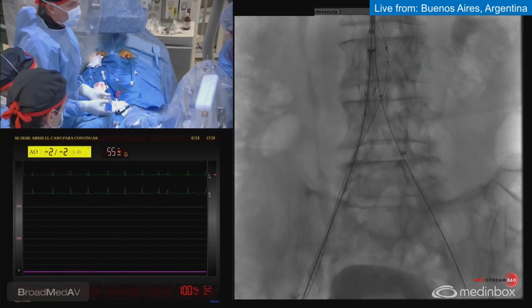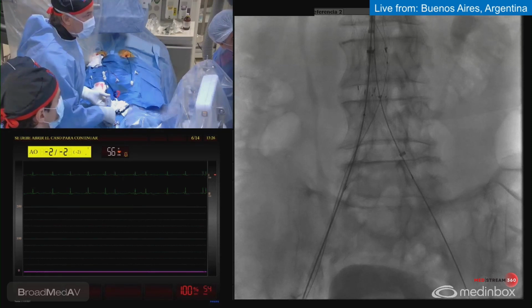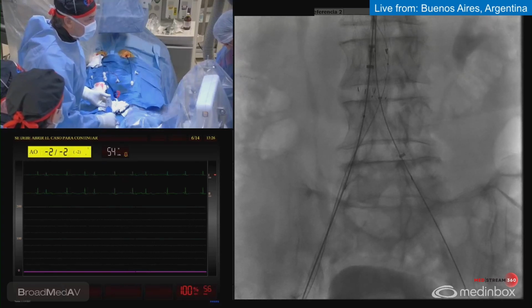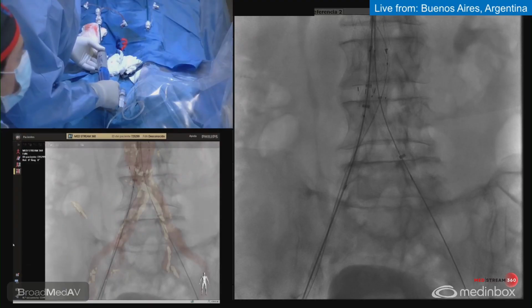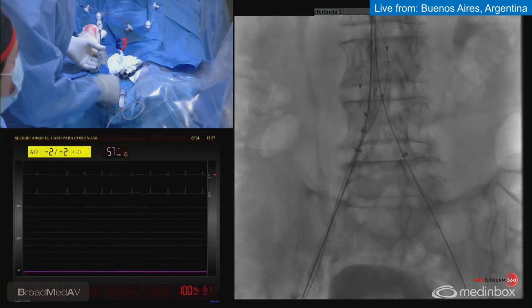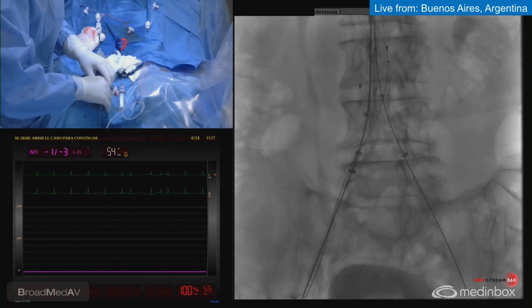I'm going to release the security. Once again, I have overlapping of the markers and I am releasing. As you can observe, everything is moving out all together, the external sheath and the internal sheath. This marker should coincide with this. Is that okay? So at this, well, one of the limitations that we can add here is a not so radiopaque device. So probably should release the proximal part now, preventing any movement.